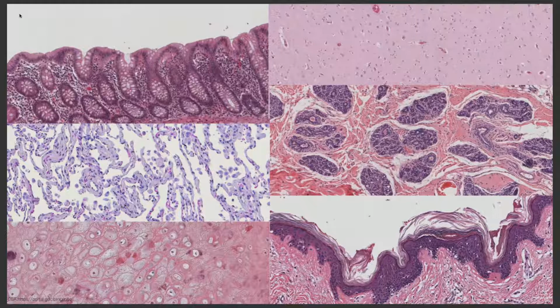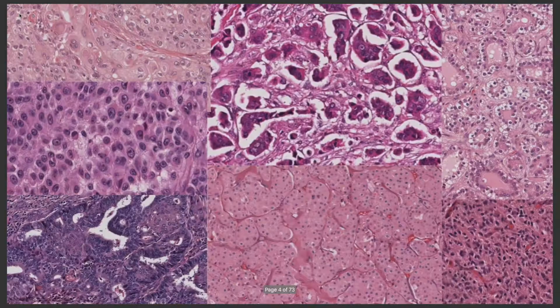And for many diseases, this still represents the core data type that defines what's going on. Is this something with a serious prognosis that requires, say, surgery, or is this something that's totally benign? All of these are different aspects of benign processes. And so just the normal human body creates all these different patterns.